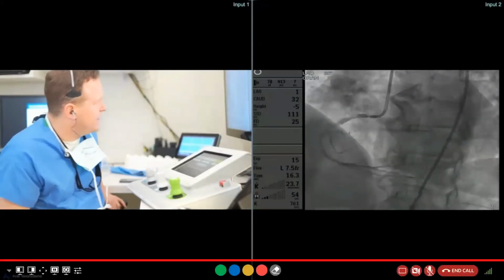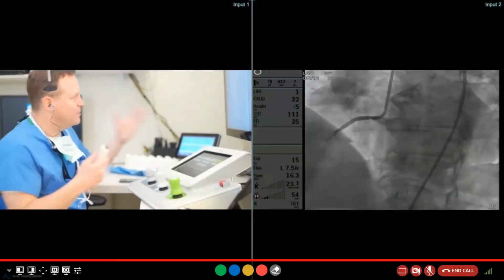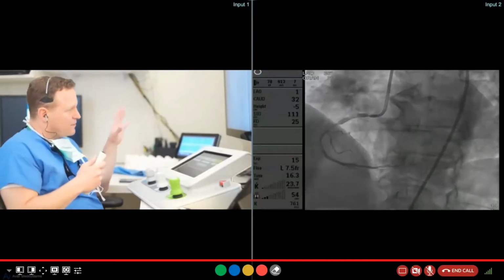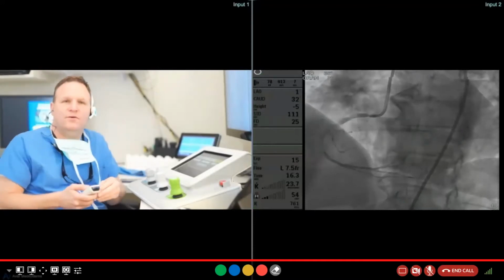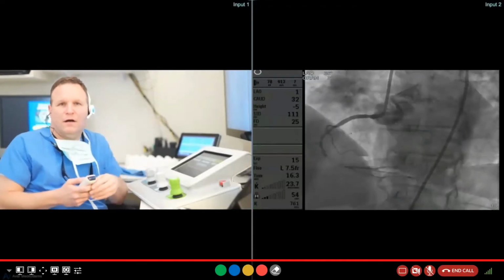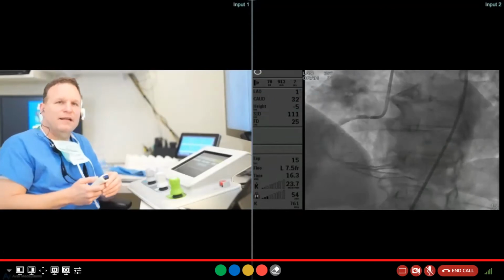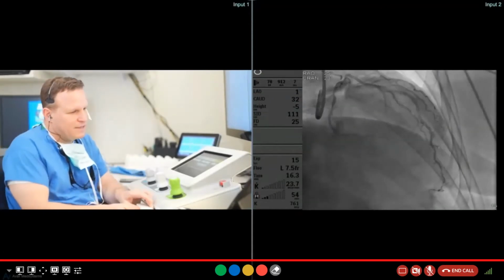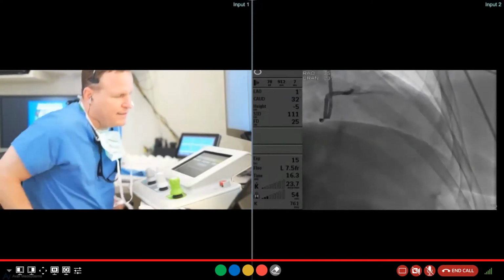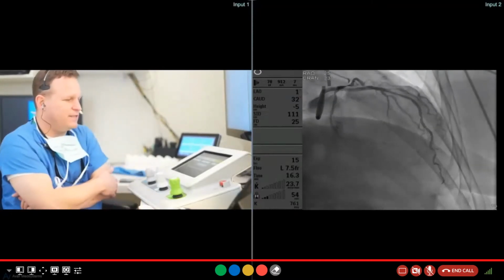So from there, we're happy to talk about that, but I'm also happy to get to the case. So we considered this a success. We were happy about this. And at this point, we were hoping to go ahead and do a hemodynamic assessment. I'll go ahead and show our coronary here. You can see there on the right side of the screen that tubular 60% stenosis.